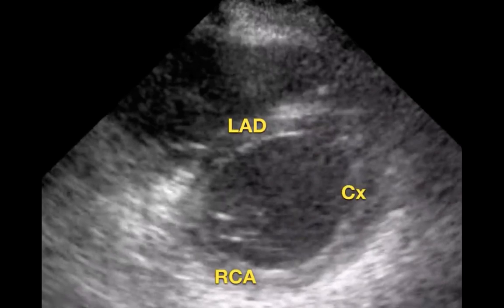When assessing for wall motion abnormalities, you can estimate where the lesion might be in this cross-sectional view. The interventricular septum is supplied by the anterior descending artery, the lateral portion by the circumflex, and the posterior portion by the right coronary artery. For a more thorough review of wall motion abnormalities, you can look on YouTube under MMC ultrasound and find a good discussion by C.J. Fox, one of our previous residents.